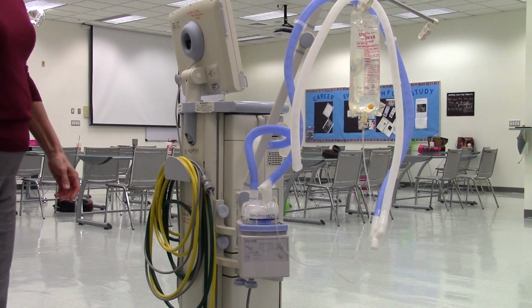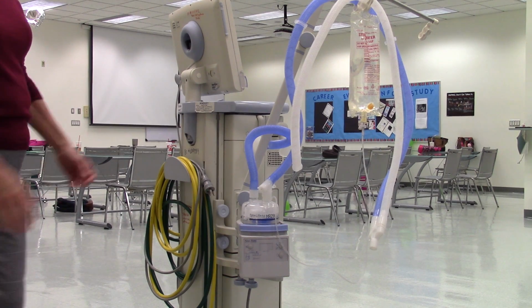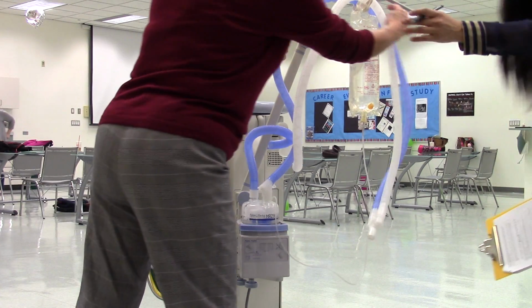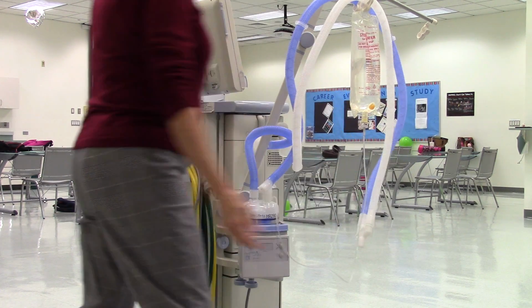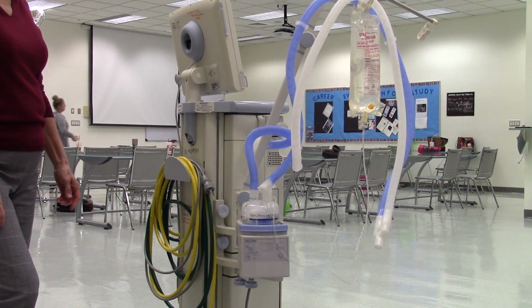So gas travels through the ventilator to the humidifier, and then passes to the patient, and then exhalation. Passes over to the patient, and then exhalation.